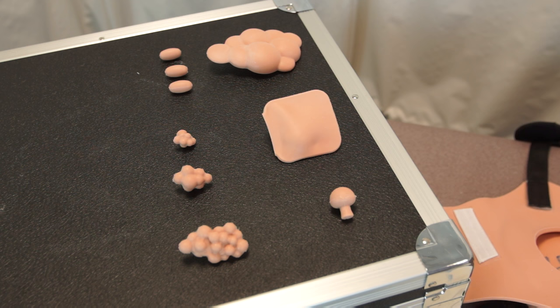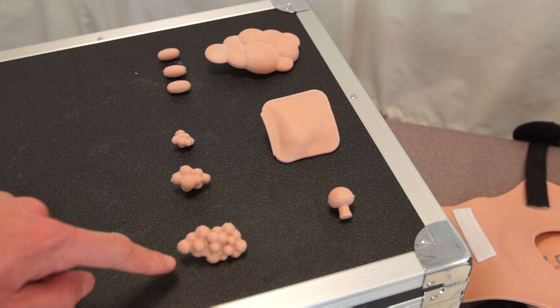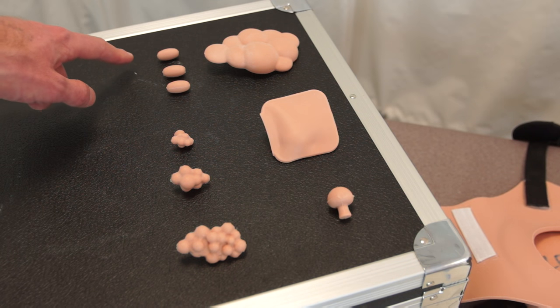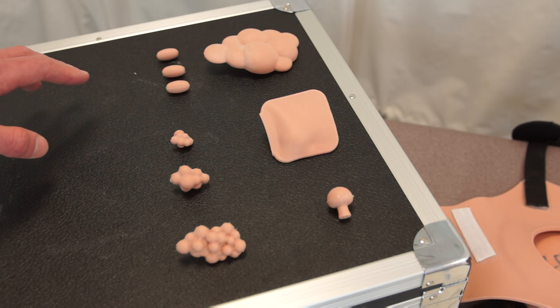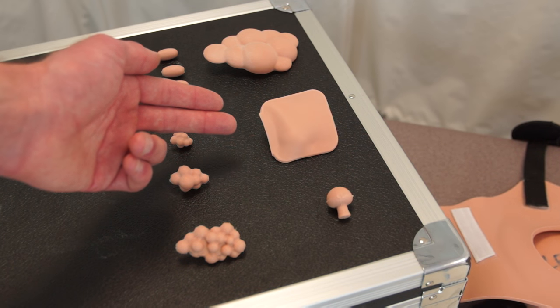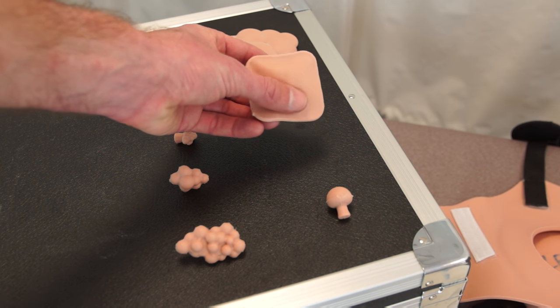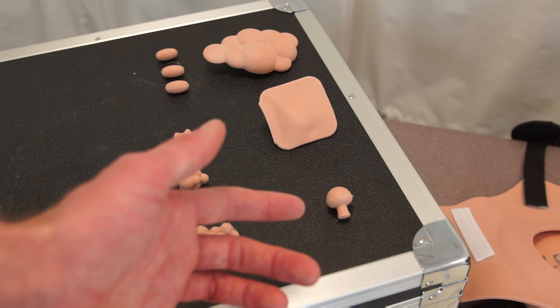These breast models can be loaded with the following five types of pathological findings: three different sizes of carcinoma or breast cancer; lymph nodes, which may or may not indicate a significant pathology; fibrocystic disease; the fibroadenoma or breast mouse, again with the mobility inside the simulation; and cysts.